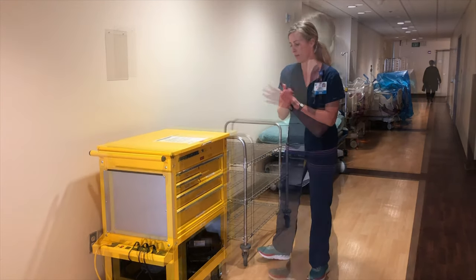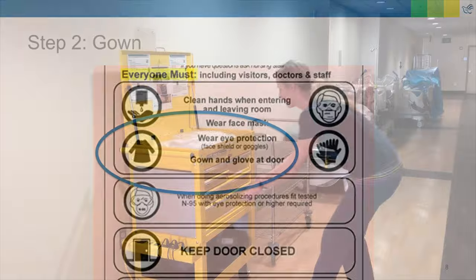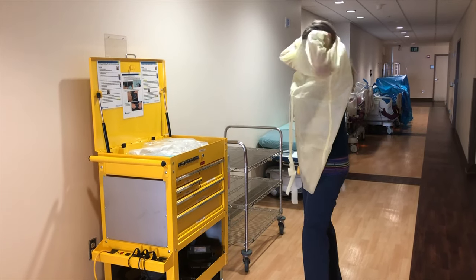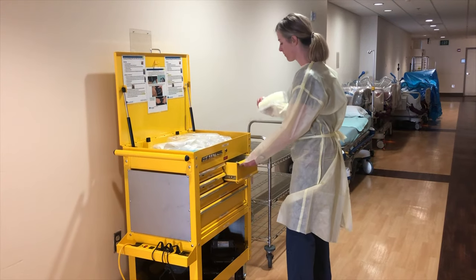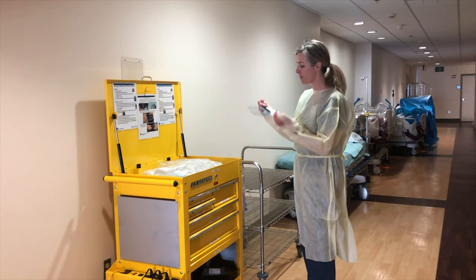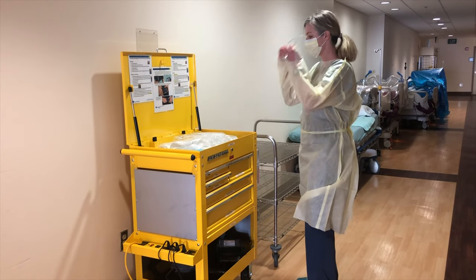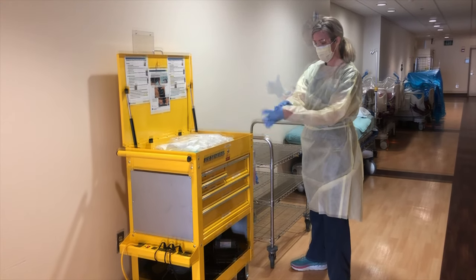Start with hand hygiene. Then don your gown. Next, don your face mask. You may opt for a face mask with integrated eye protection if one is available. If your mask does not have eye protection, protect your eyes with safety glasses or shield. Finally, don your gloves, making sure that there is no skin visible between the cuff of the glove and your gown.